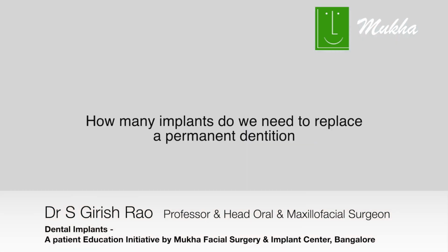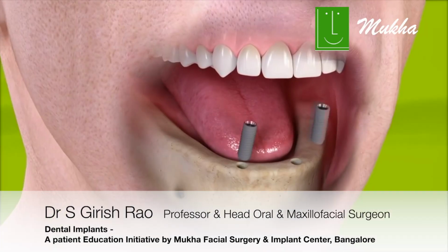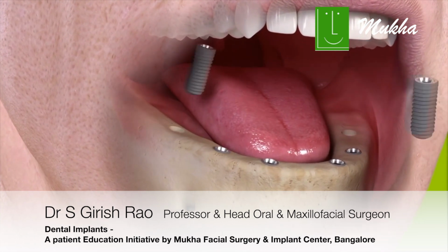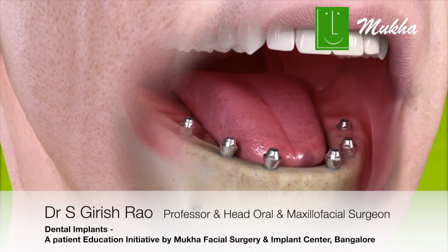How many dental implants are needed to do a full mouth rehabilitation? When all your teeth are lost, there are different techniques by which we can do this. Traditionally, we have been using 6 or 8 implants in each jaw. These take the support, and then you fix a bridge on top of that.